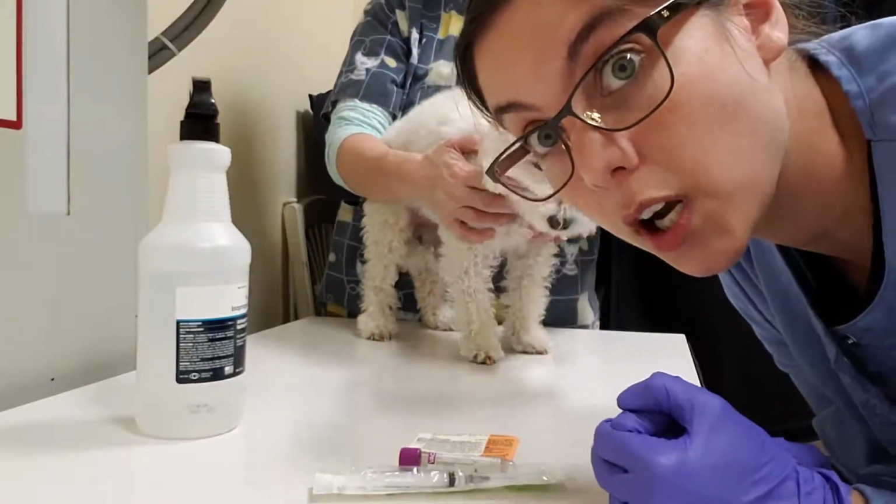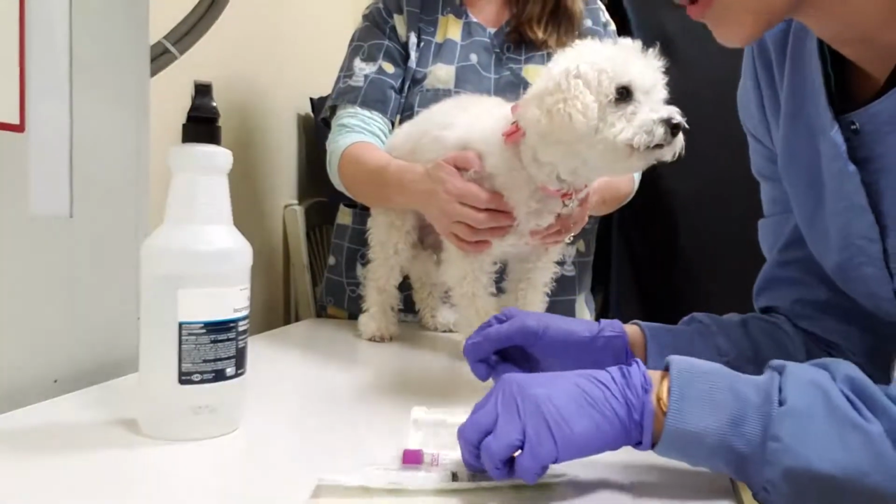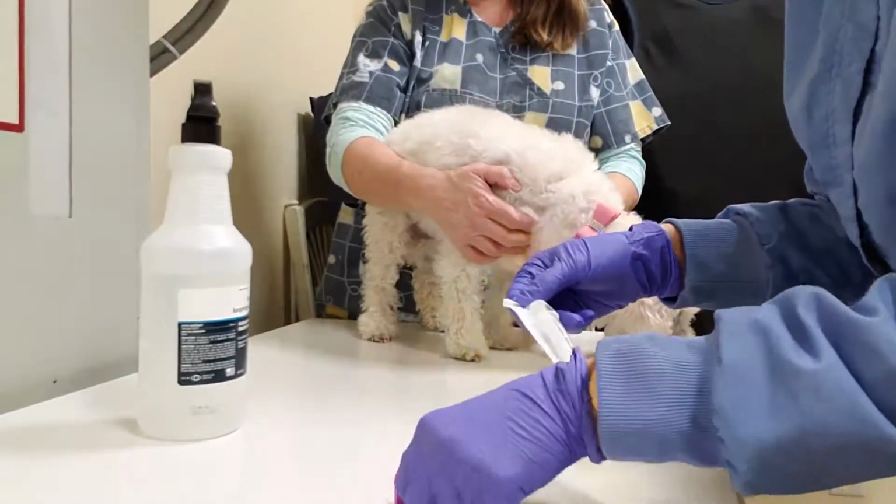Okay, so now we are getting the blood for our recipient cross match. So we've got our purple top tube, we've got our supplies to get blood.